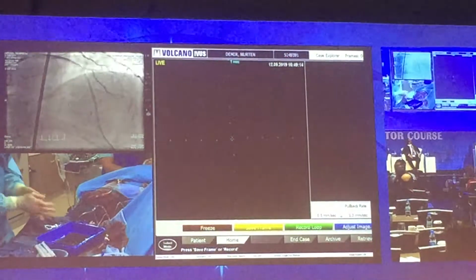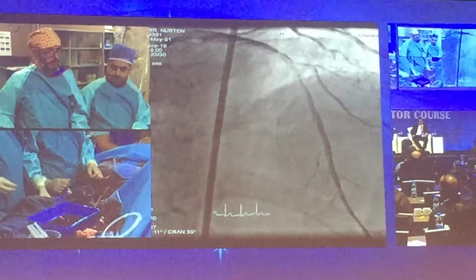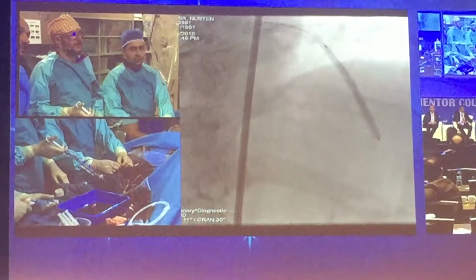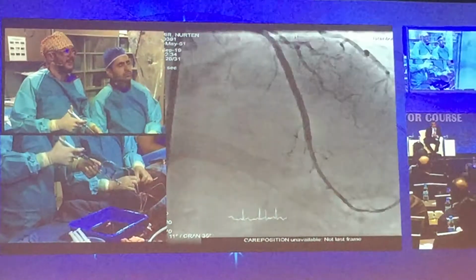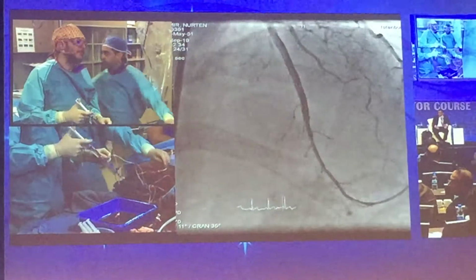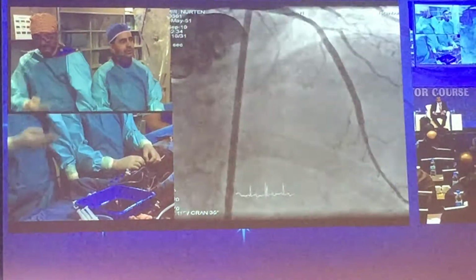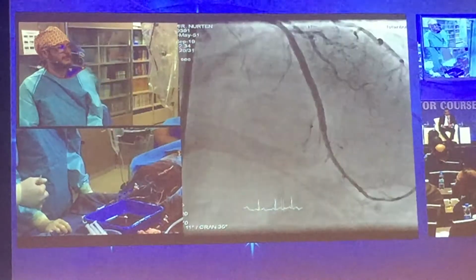Can you have a shot from a different angle? Restrict flow. If you restrict the flow and implant the stent, you chose the stent implantation and I think you left the gap. You leave the gap. I think you will leave the gap over there.